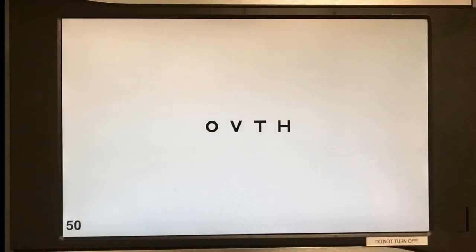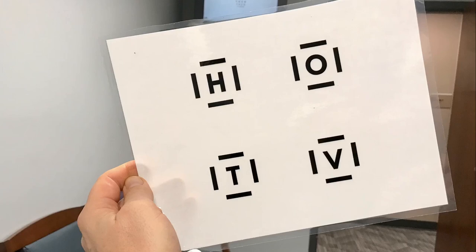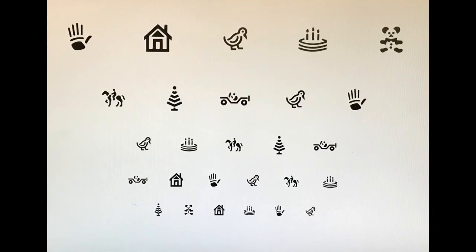Optotypes should be presented as a full line rather than as single letters, which will tend to overestimate visual acuity. However, using crowd bars with a single letter optotype is an acceptable alternative. Matching cards can also be useful when testing younger children. Allen figure optotypes, while easy to test with, are not recommended as they tend to overestimate visual acuity. Lea symbols are a better alternative as they tend to be more uniformly constructed and consistent.